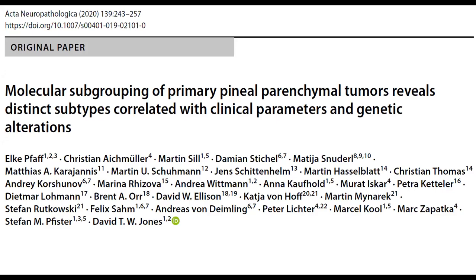We have to acknowledge, of course, methylation profiling and modern genetic parameters. However, the genomic alterations are not altering right now treatment for PPTID. Everything I've shown you is all you really need. Just the basic immunostains.